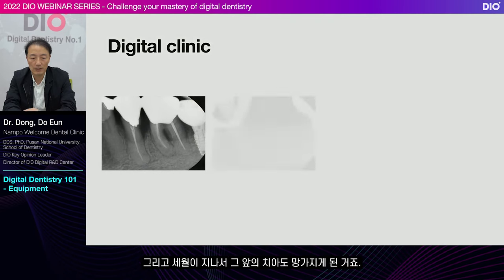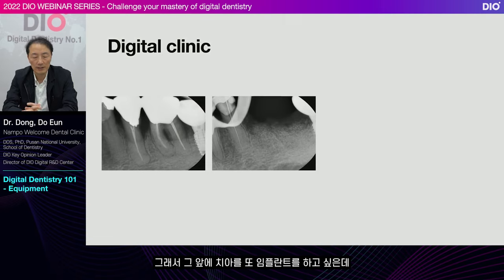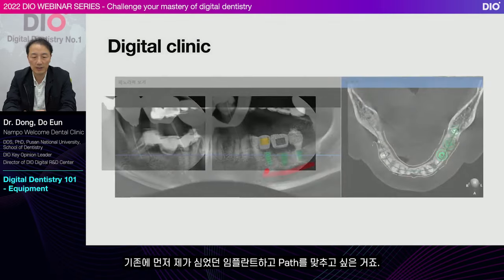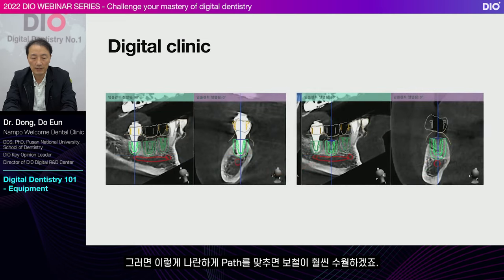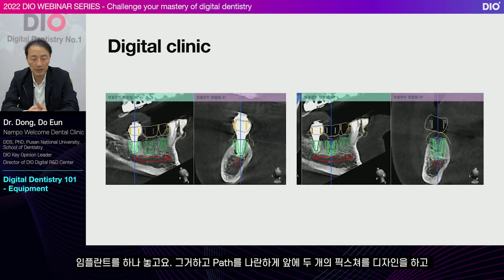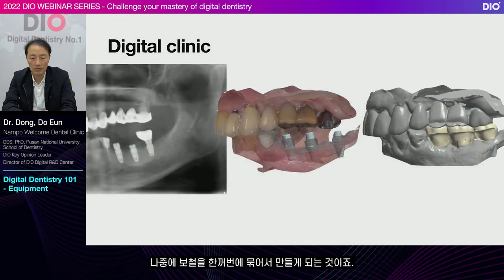And time passed, and the tooth in front of it got damaged. So another implant needed to be placed in front of that tooth, and I wanted to align its path with the previous implant I had placed. If the path can be aligned like this, the prosthesis will go a lot smoother. So where the previous implant was, I place one implant, then design two fixtures with the same path in front, and create the prosthesis as one later.